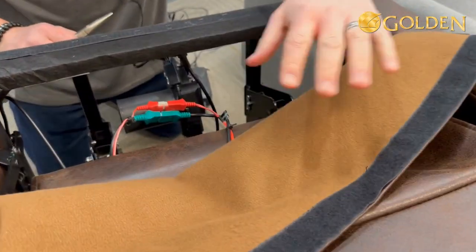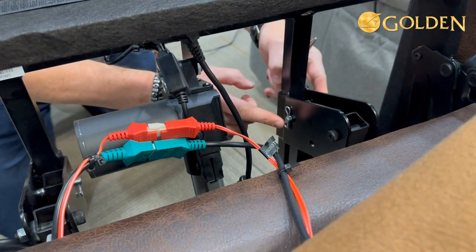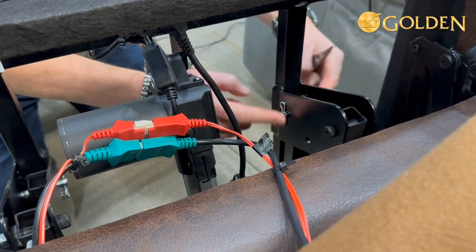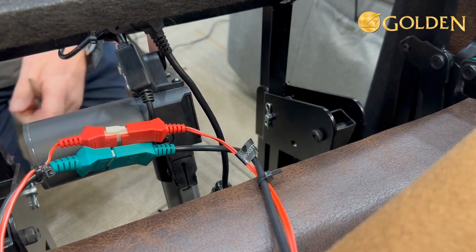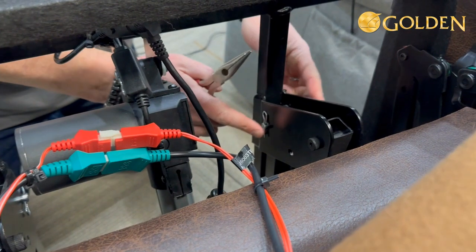You can see that all we have to do at the back of the frame is move this pin from the lower hole to the upper hole. There's one on the left side and one on the right side, so there's only two you have to worry about.